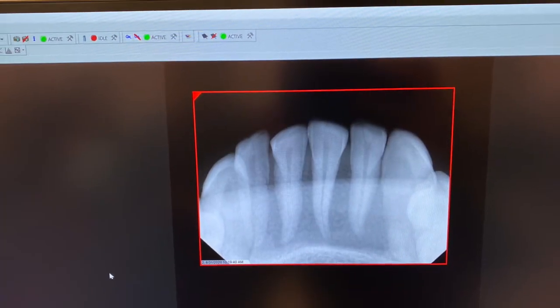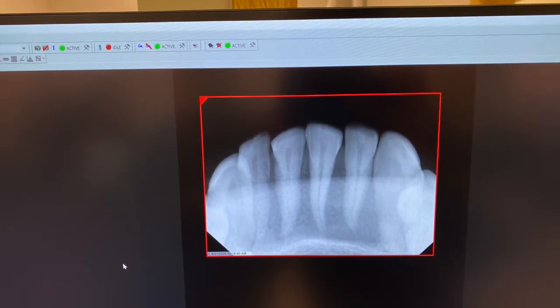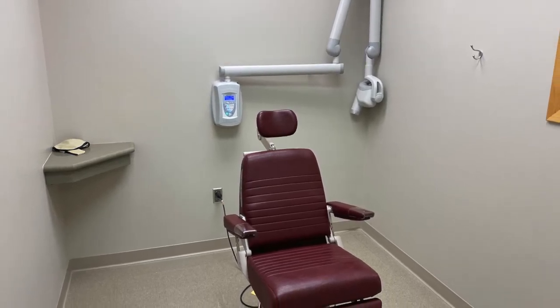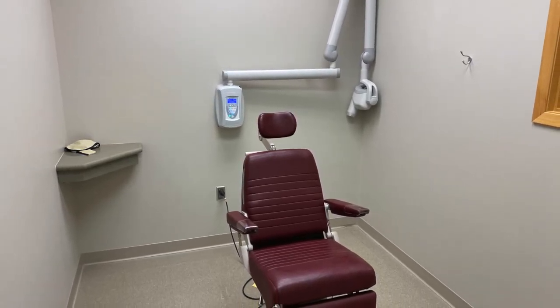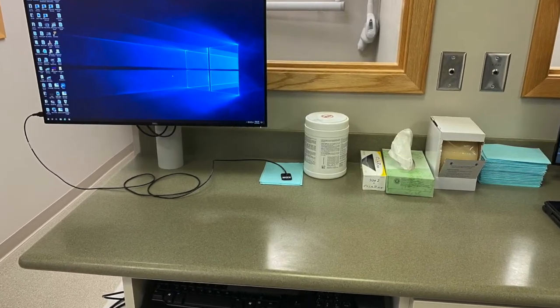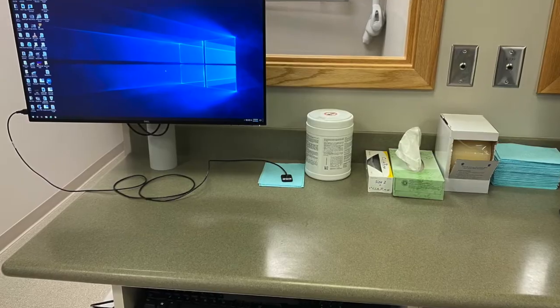This is a proper image of a mandibular occlusal radiograph. Remove protective barriers and use four Caviwipes to wipe down the x-ray unit, thyroid collar, sensor, and counter. Before logging out of SOLUDE, make sure x-rays are approved and authorized by the radiology staff.